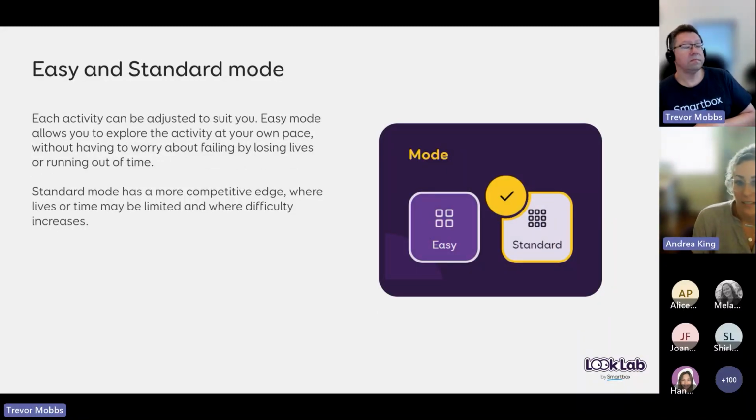And then with those sizes, this is where that comes in. We have standard mode and easy mode. So when you think about easy mode, you're going through learning how to do the activity, how to play it with really no ramifications or consequences that will happen. Versus when I move into standard mode, that's where you start to really get that challenging part where you have lives and sometimes you won't make it and you're going to lose the game. And it just has that more competitive edge to it, and time can be a little bit more limited as well.